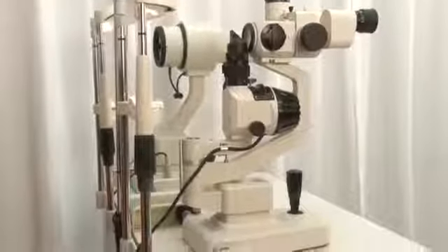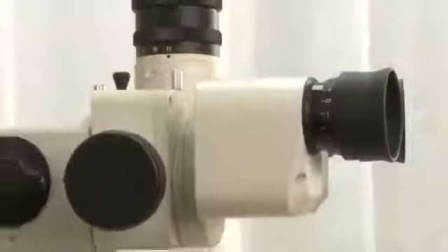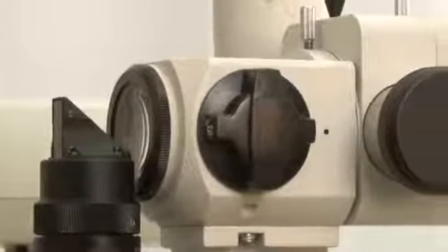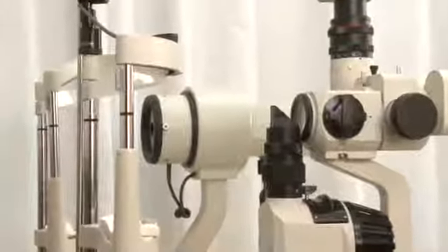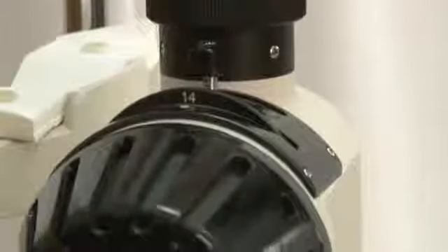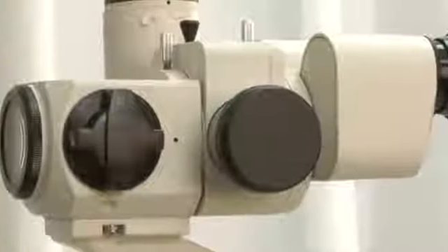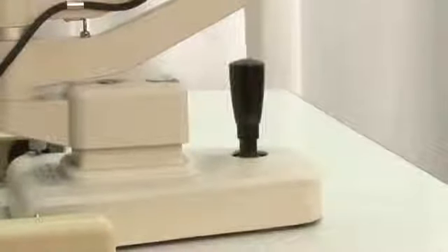Its wide magnification range, variable illumination system and unlimited angle of view make it indispensable for viewing ocular tissues and performing diagnostic and treatment procedures, including corneal evaluation, crystalline lens observation, gonioscopy, tonometry, laser procedure, fundoscopy and contact lens evaluation. This video will demonstrate how to use a slit lamp and perform different techniques.